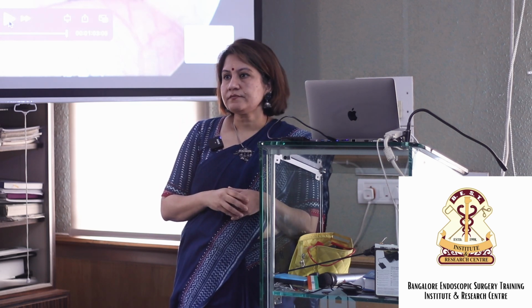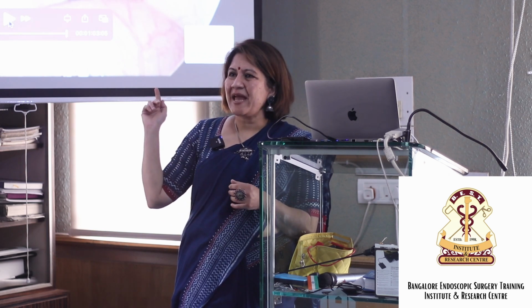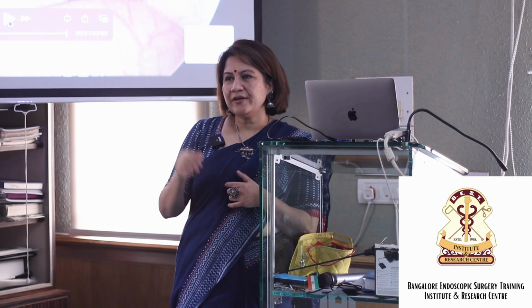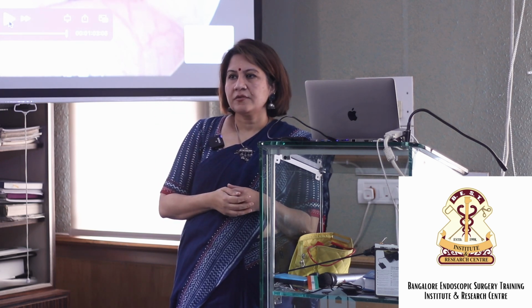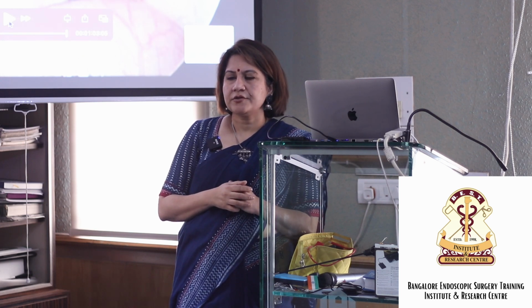Tubal perforation, we just observe. It's very thin, because this is a 1 mm guide wire, so it won't do any harm. Only the cornua is a little vascular, so you'll have to keep pressure for some time. It will settle down. You can't cautery there anyway. But I don't think it's a big problem. Tubal perforation is not a big problem.